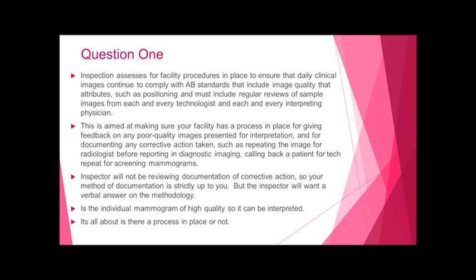Because usually in diagnostic imaging, you go show the radiologist the images before the patient goes. If they don't like it, you're going to repeat it before it's read. But in screening mammograms, they should be read first and then call the patient back, because they're going to have a different date on there. So you want a report. Don't repeat it and then do the report, because it's going to have a different date.